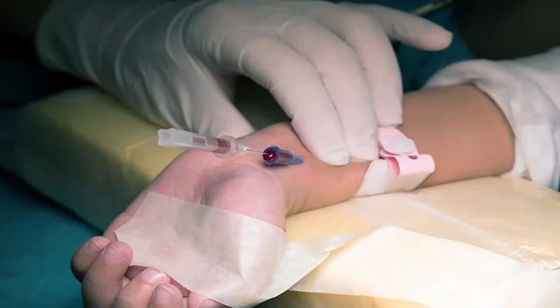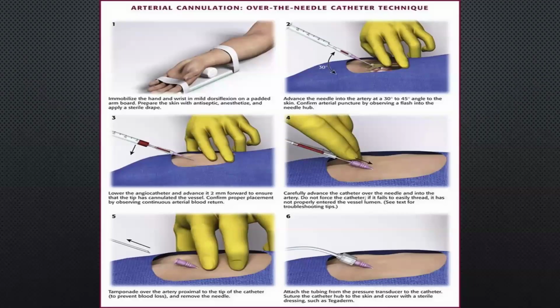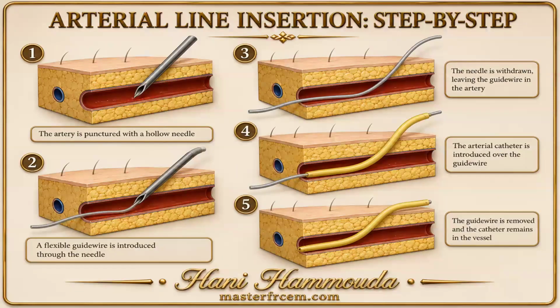Having palpated the radial artery, you could introduce your needle gently. Once you get a flush, then you try to stabilize the needle while you bring out the syringe, while you bring out the needle. Once the needle is out, sometimes if the blood is very red, that gives you an idea that definitely it is in the artery. But sometimes in those that are hypoxic, it may not be as red as you anticipated. So don't really trust the color of the blood for you to know that it's in the artery. So adequate landmark and having palpated for your vessel will suffice.